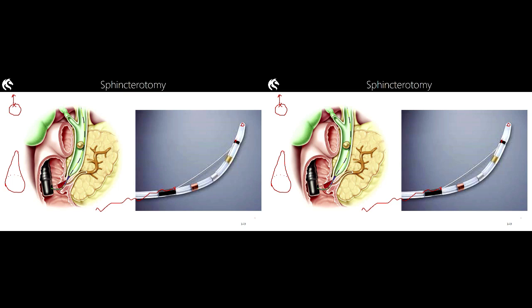Okay? Where do you put this wobbly gel pad? On as much buttock as you can. Okay? The gel pad wants to get the maximum contact with soft tissues, so you need a broad area of flesh, so you are going to stick that blue gel pad onto the patient's buttock or upper thigh, wherever you can get a nice big strong contact with the body, and that's going to have a lead coming off it to go back to the ERCP machine. We can now electrocute the patient as much as we like.